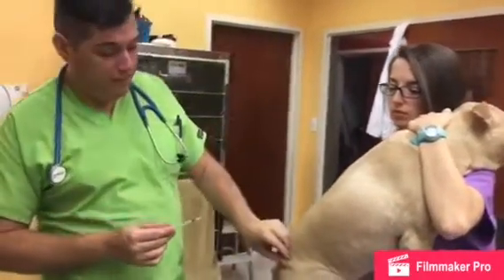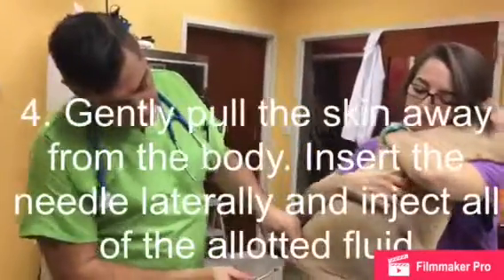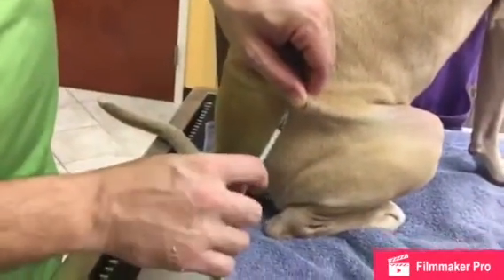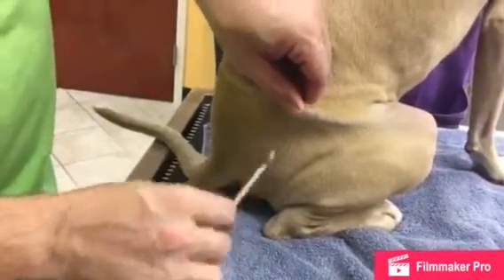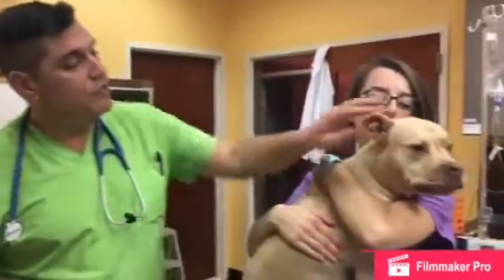We are going to go to the hip. We're going to tent the skin and pick it up so it's away from the dog's body, go lateral with his body, push it all the way in, then pull out straight. Beautiful job, Filbert.